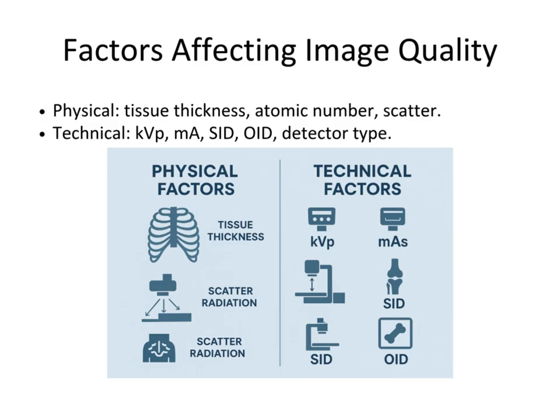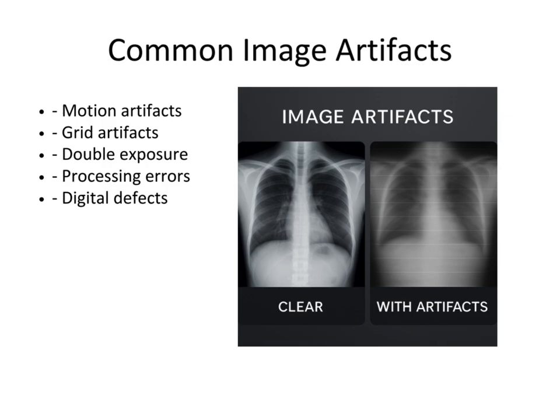Artifacts are unwanted marks or patterns that can mislead diagnosis. They may result from patient motion, grid misalignment, and mismatch, double exposures, or detector issues in digital systems. Identifying and eliminating artifacts is key to maintaining high-quality diagnostic images.